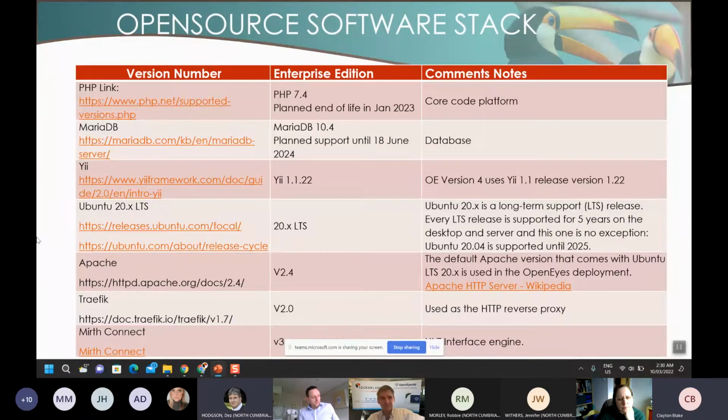Okay. I'm probably stepping on other people's toes here, but I couldn't tell whether that was a web-based client or an actual fat client that needs to be deployed out. No, OpenEyes has been designed for the web. It's pure web. It's not like other systems where they say it's web-based, but there's a Citrix system running over the top.